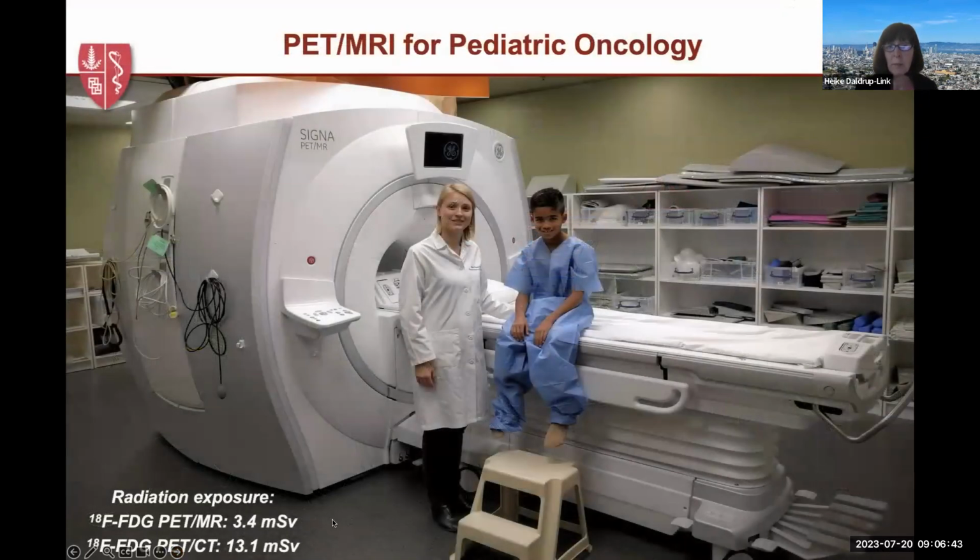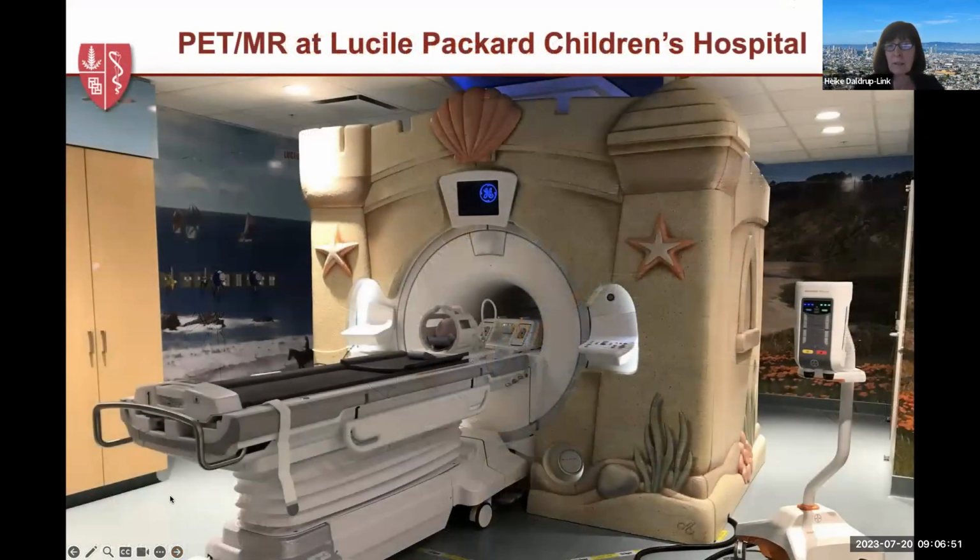This here is a PET MRI scanner when it's in use at our Lucas Center at Stanford. And this here is a second PET MRI scanner that we have in the Children's Hospital for routine clinical use. So we have two PET MRI scanners for children with cancer at our disposal.